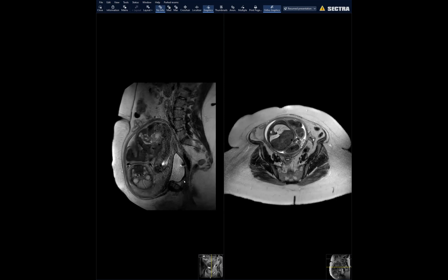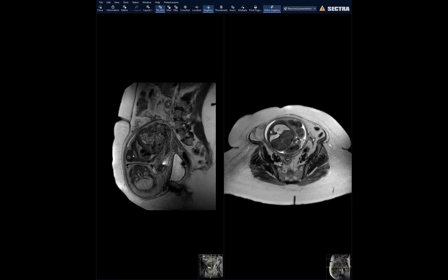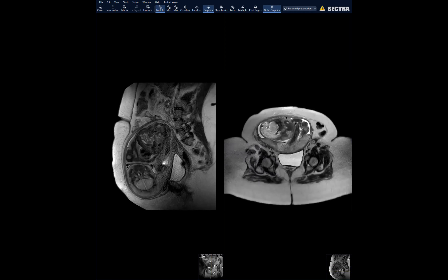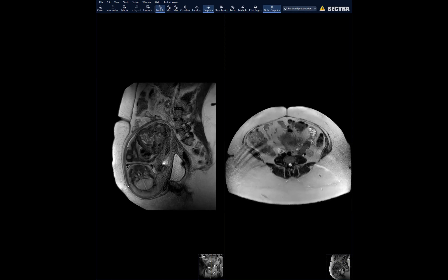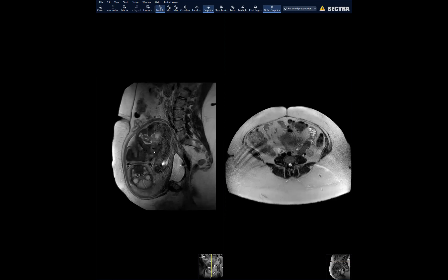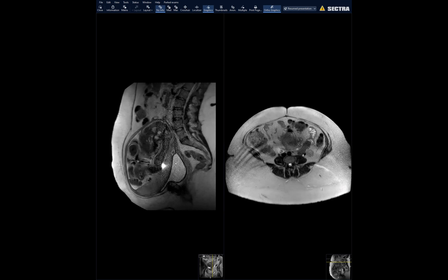That's all it is in this case — the uterus has flopped anteriorly. She was morbidly obese, and as a complication of pregnancy she had weakness of the anterior abdominal wall: we see very little musculature, significant fatty atrophy of the rectus muscles, and bulging fascia. That couldn't hold the gravid uterus and it flopped anteriorly. This is called anterior uterine incarceration — not a common entity, and with obesity an epidemic, we may see more cases. Only one case report was found in the literature.